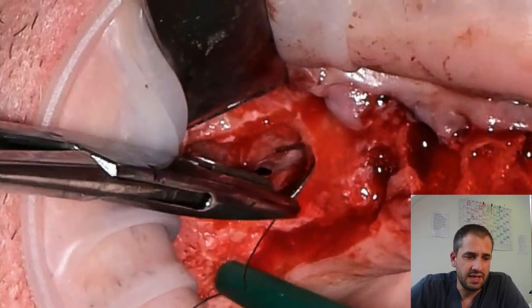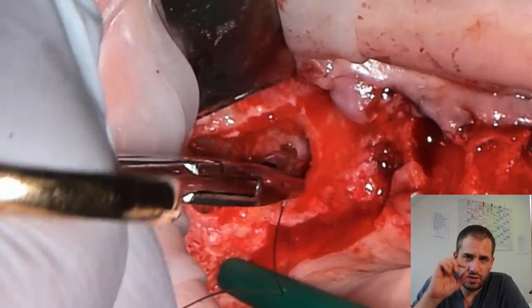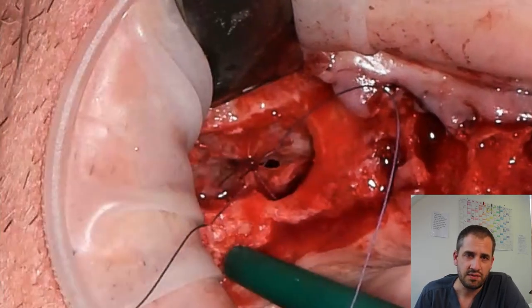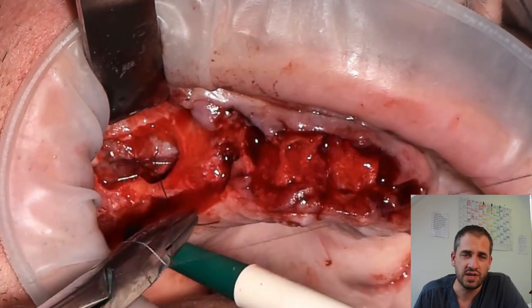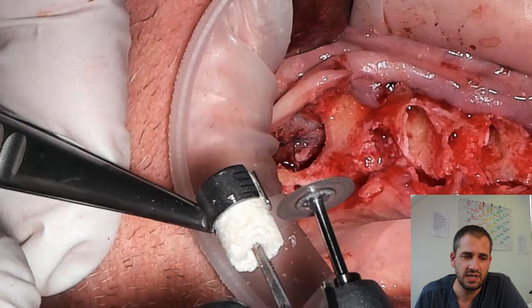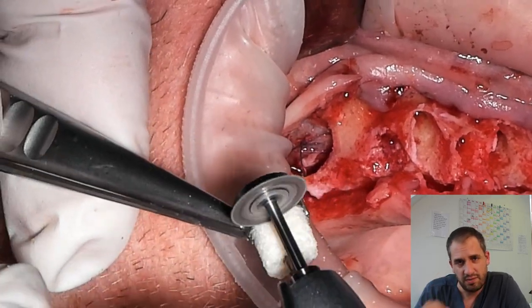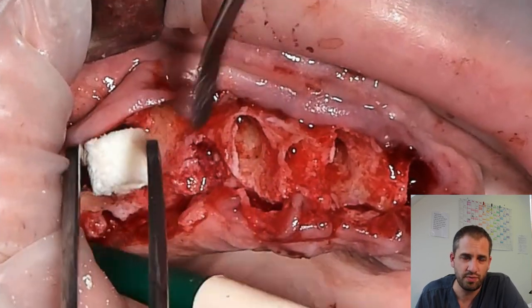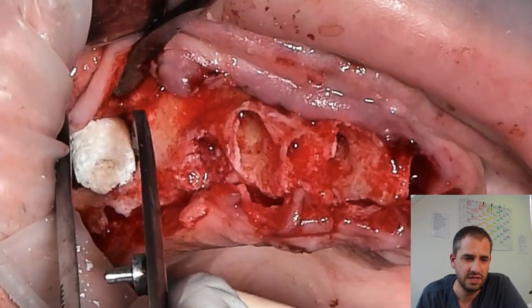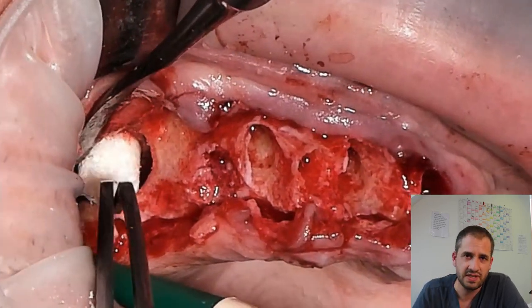We have seen on the x-ray that there's only one millimeter of bone left to the sinus. So I use the allograft ring technique for primary stability for the implant. I cut the 10-millimeter long ring into two pieces of five millimeters, and then I place the allograft ring into the sinus.